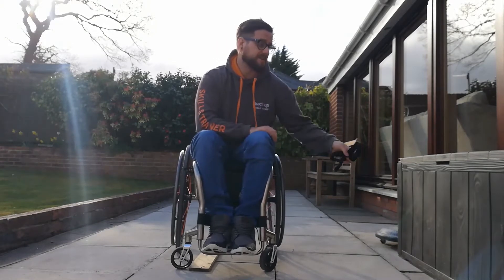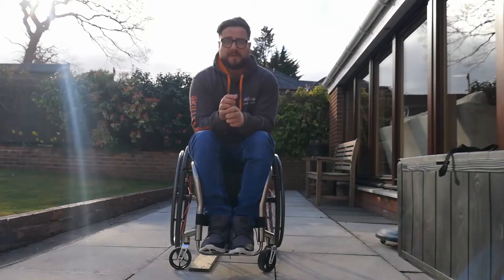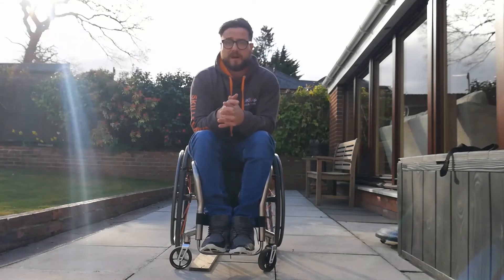Safety first with these skills. It's important with this skill that before we start, you have quite a good mastery level of back wheel balances.